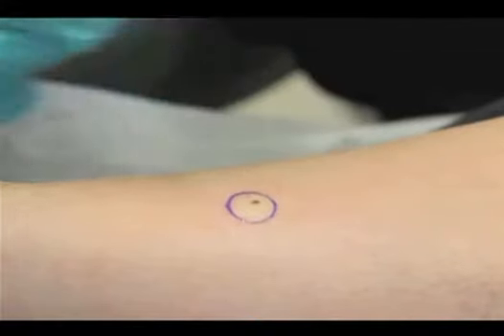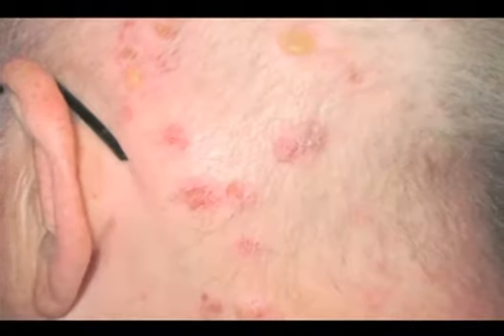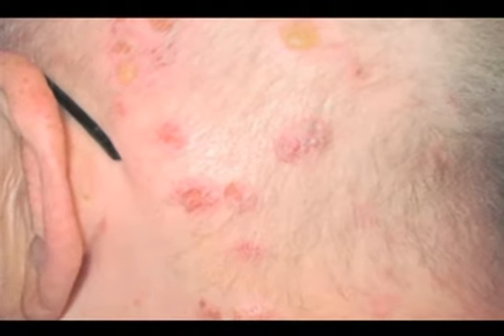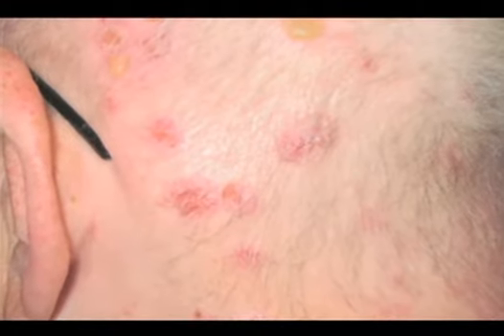The effects of lidocaine are almost instantaneous. In highly vascular areas such as the scalp, lidocaine with epinephrine should be used. In addition, it is prudent to wait several minutes to allow epinephrine to exert its full vasoconstrictive effects, minimizing intraoperative bleeding.